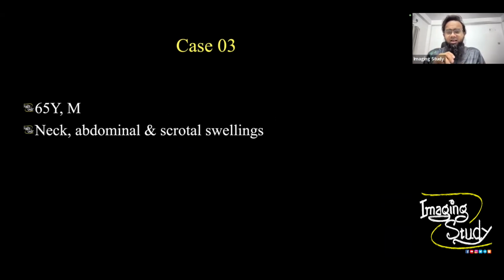If you missed it, this patient took around 1 hour to scan and around 1 hour to complete the report. Actually, the patient took 2 hours of my life to solve all of these things. I posted on my Facebook profile yesterday that I had a very time-consuming patient, and this was the second most time-consuming patient yesterday.